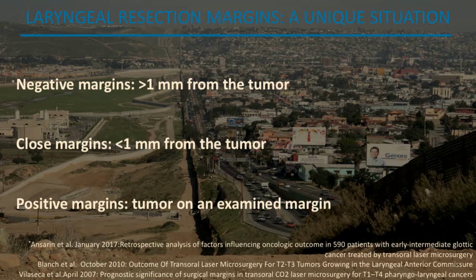So the margin of the resection has a unique situation in laryngeal surgery. Of course, we are talking about ultra narrow resection, as you have seen, 2-3 millimeters.